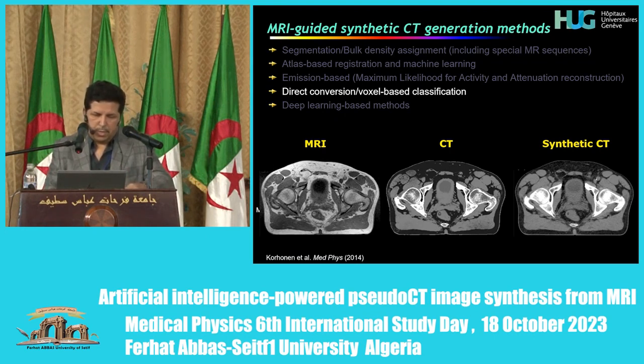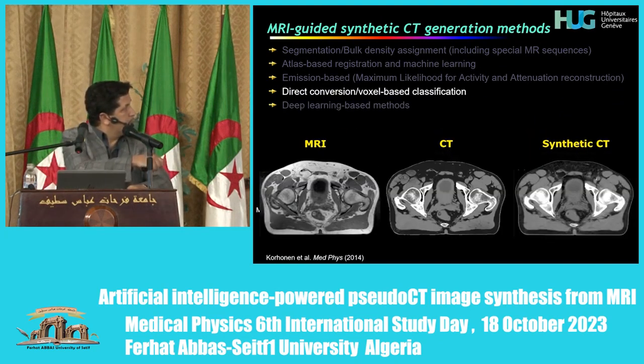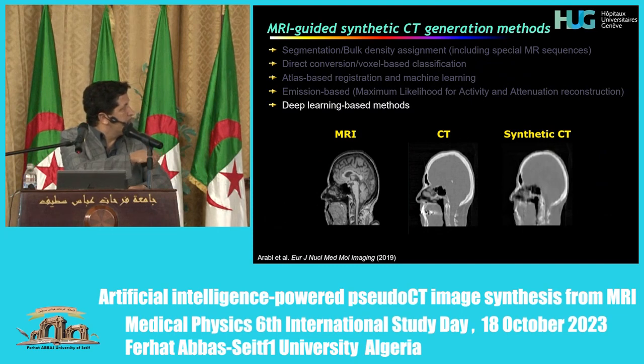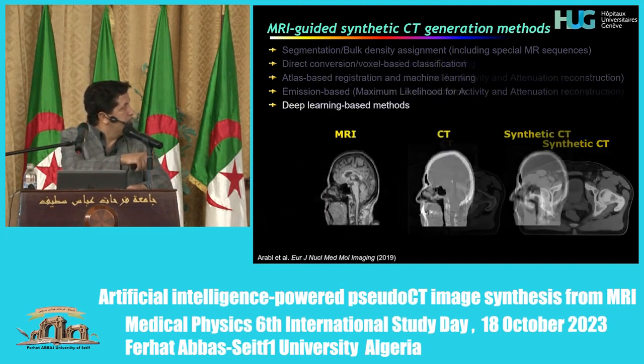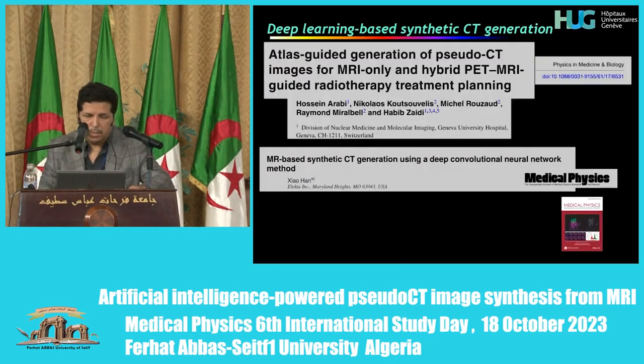Deep learning techniques have emerged more recently, and you see how realistic the pseudo-CT image can be when generated from the MR without this intermediate step, which is CT. You see nicely here the nasal cavities and the skull, which is extremely well predicted by the deep learning model.